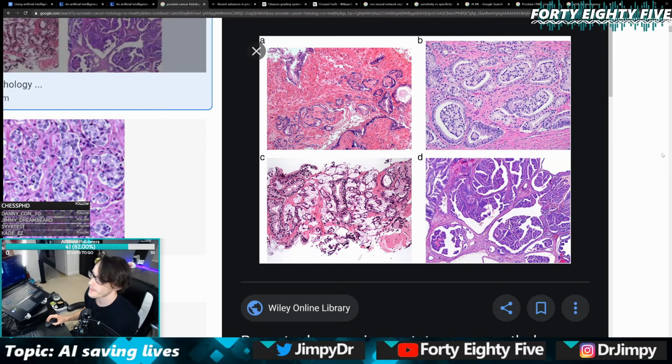And what you end up with is a picture like this. Now, histologists and pathologists, the guys in the hospital, the clinicians, the men and women that do this, they'll make the diagnosis based on years of experience, and they know what a normal prostate looks like versus a prostate with a cancerous growth in it. They really rely on the fact that they are absolute experts in their field. They can look at an image like this and go, oh, top left is fine and the bottom right is cancerous, or the top left is cancerous, and they can effectively look at an image and call it.